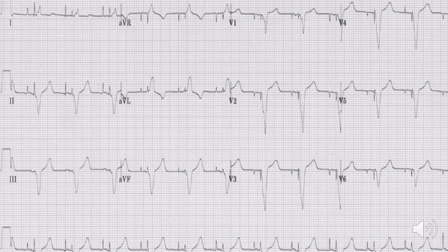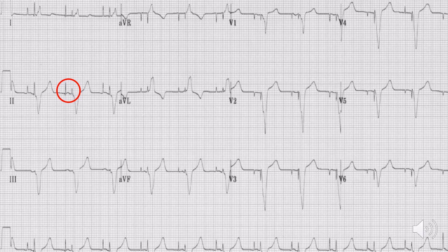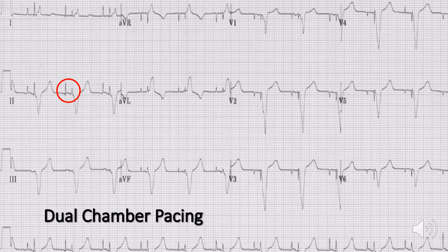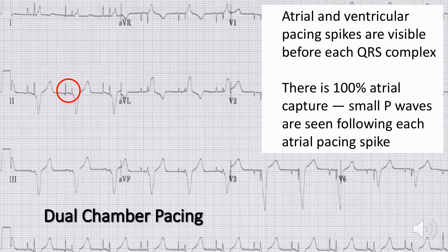Let's look at a few examples of ECGs. This is an example of an ECG in dual chamber pacing. As highlighted in the red circle, you can see both the atrial pacing spike as well as the ventricular pacing spike.